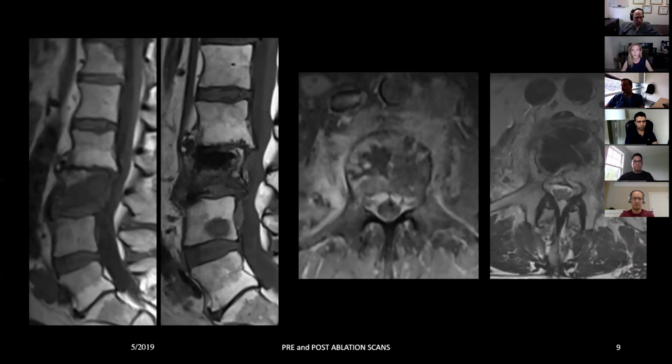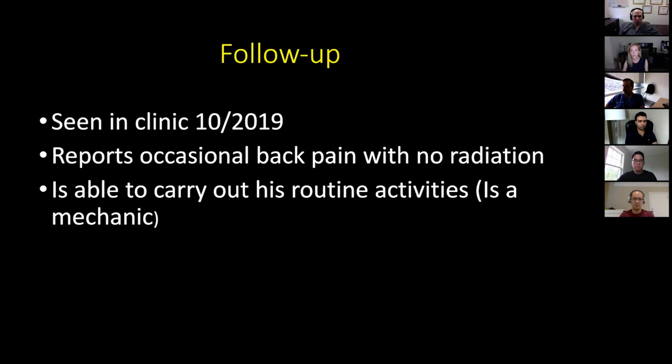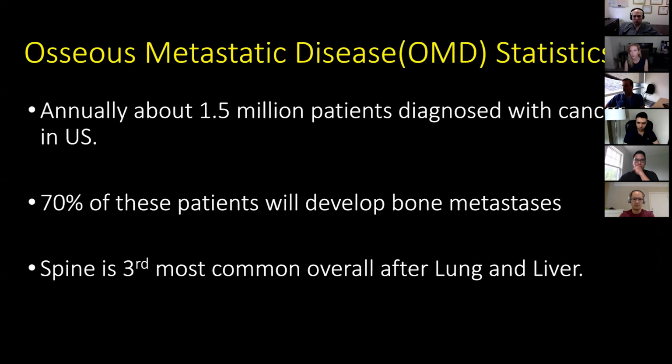So just to give you an idea about pre and post ablation and cementation, what it looked like, and our ablation zone was pretty good in this patient. He's a mechanic, and he's able to carry out his routine activities now, and we're still following him, and the pain is significantly bearable. Actually, I'm doing some facet blocks on this patient.